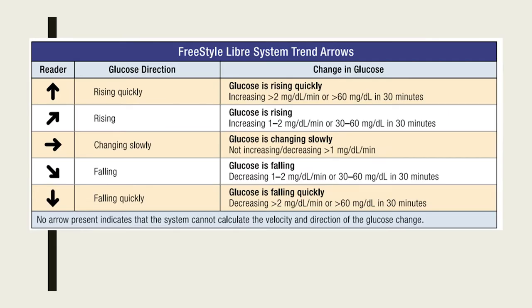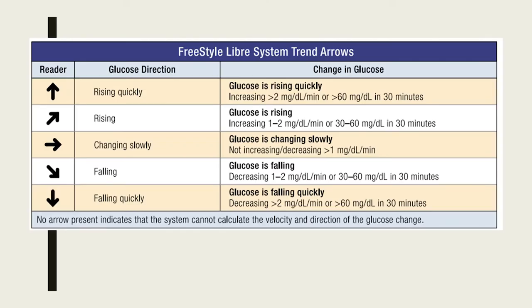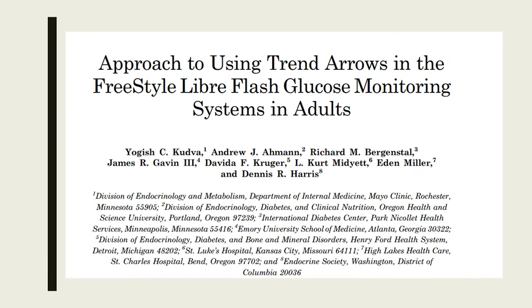Again, the Libre still gives you trend arrows, which, as I mentioned before, are hugely valuable. They let you know whether it's rising a lot, rising a little, stable, falling, or falling quickly. These are very important. Imagine somebody's going to get in a car and they check their blood sugar and it's 120. Well, if you know that you're falling rapidly, that's a different place than if you're nice and stable. And if you're about to go for a drive, everybody who's been in the field of diabetes knows a type 1 or type 2 that has died or nearly died from a car accident. It doesn't happen all the time, but you only have to know a few people to be mindful of the significance and importance.